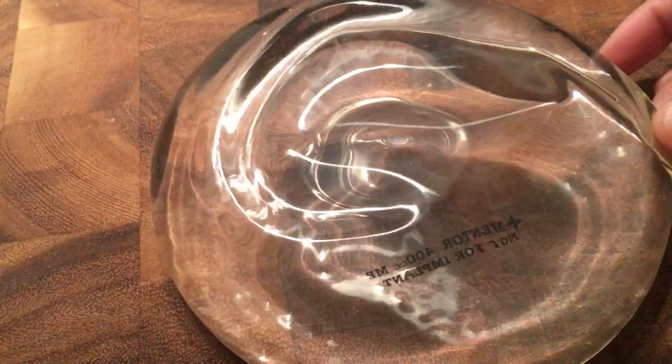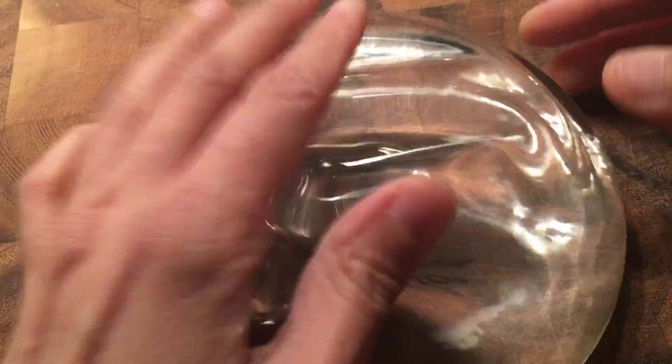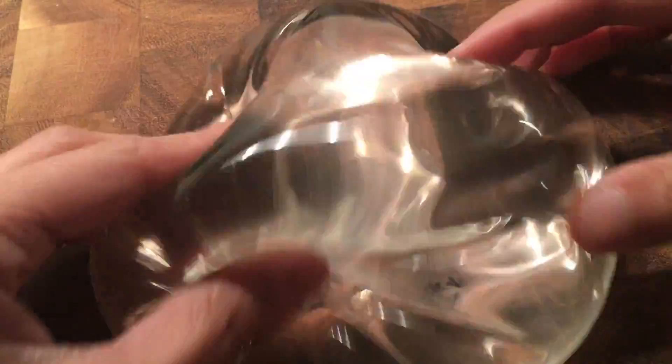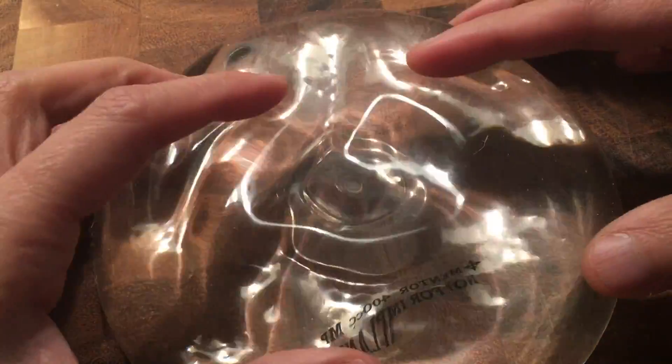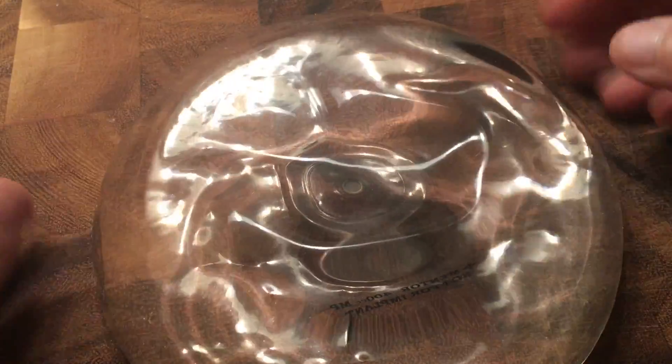Now these are both silicone gel implants. This is a smooth round silicone gel implant. It's a traditional silicone gel. It's not a cohesive, it's not a gummy bear, it's a silicone gel.